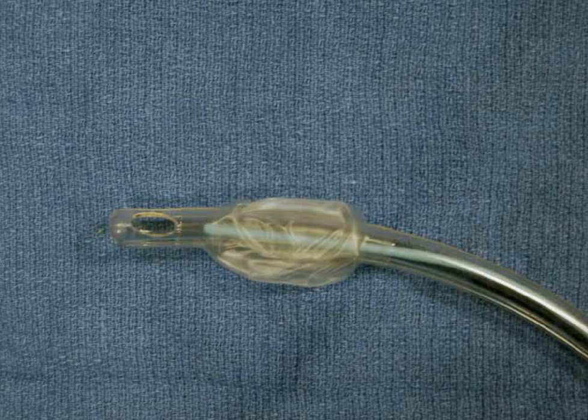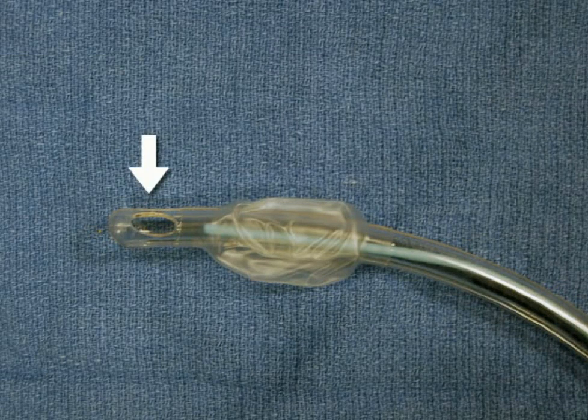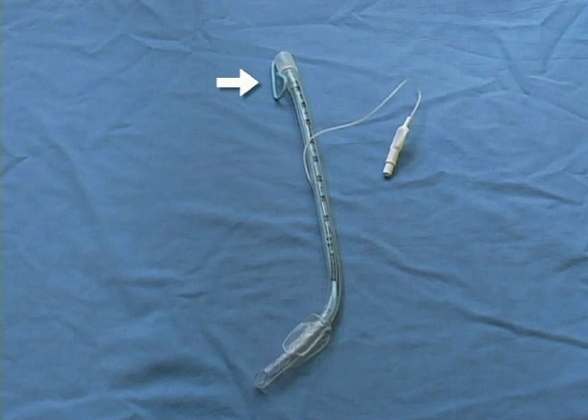Place the stylet inside the tube. The stylet should not extend past the Murphy eye hole of the endotracheal tube. Fold the stylet over the edge of the tube to fix it in place. Then bend the tube at a 35-degree angle in the shape of a hockey stick.